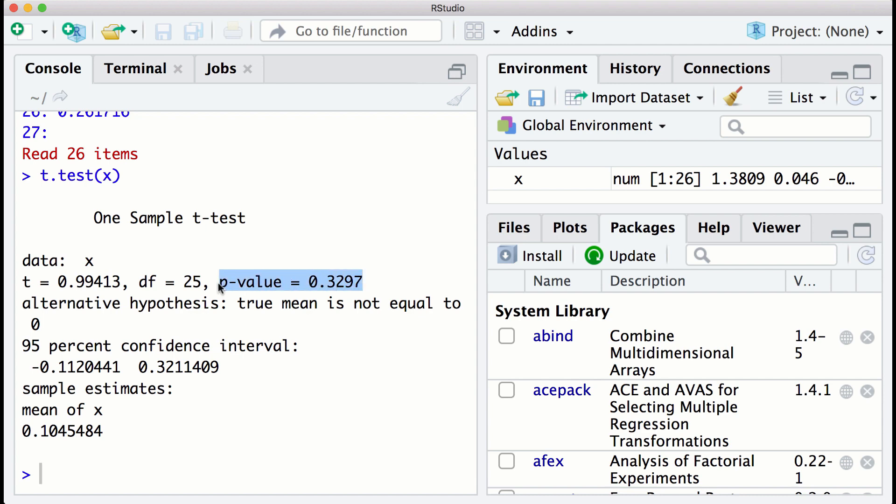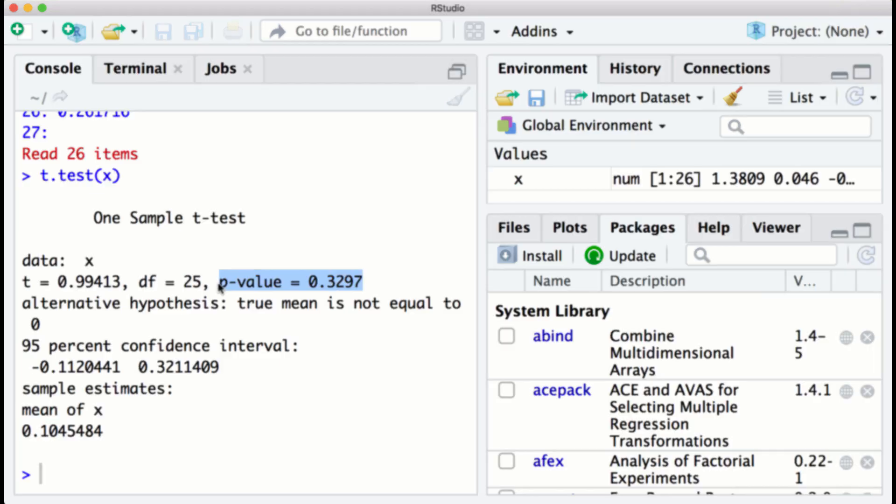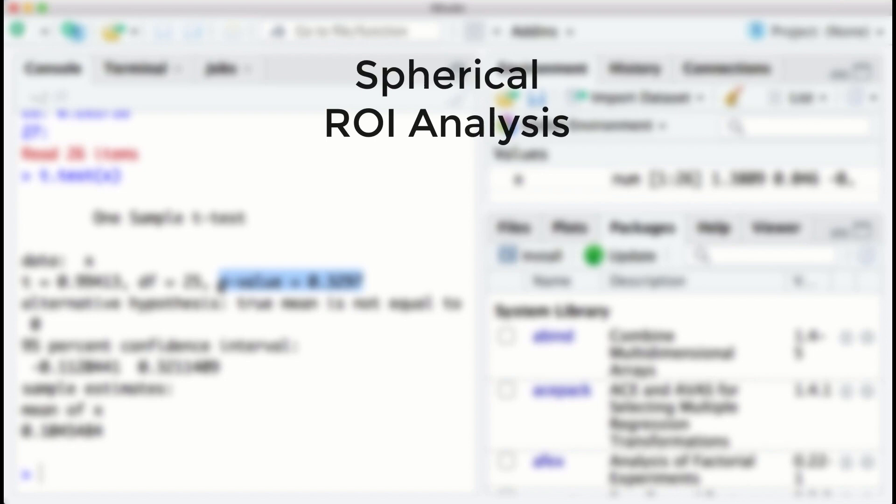These results, as you can see, aren't statistically significant. This may be because the anatomical mask is so large that it encompasses several distinct functional regions. In this case, we can instead use a spherical ROI analysis.